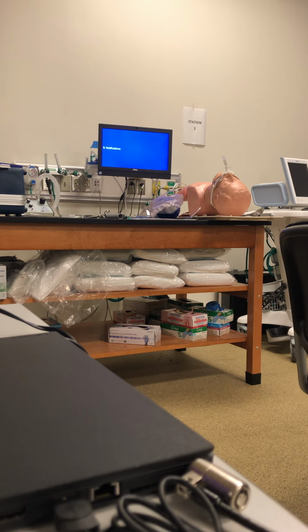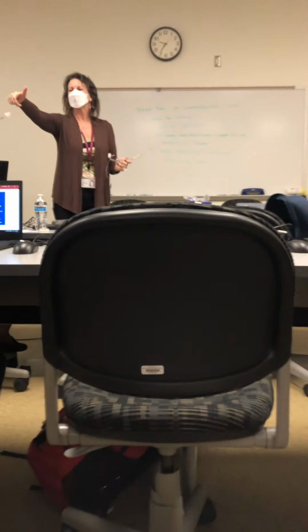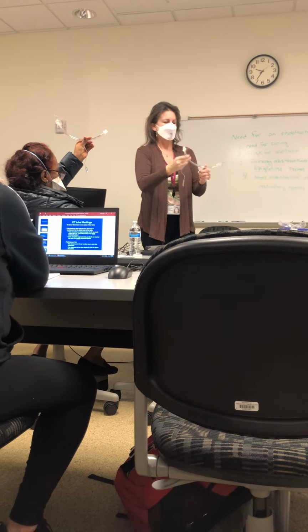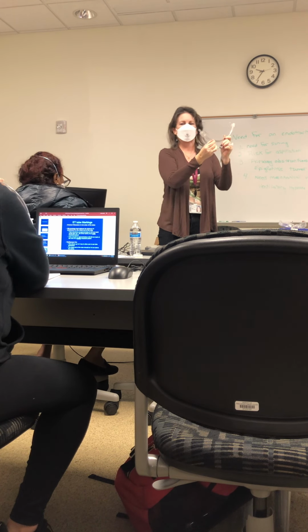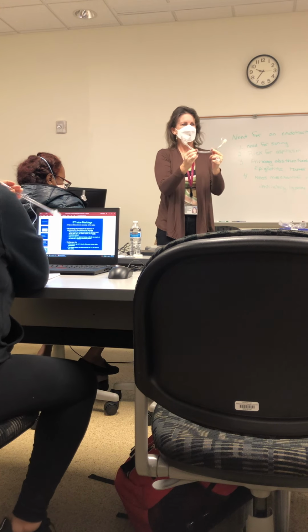7.5. So hers, show them. Hers is at the top. It's up here. Mine is 8.0. Mine is right here. And it's in millimeters. Does everybody see their tube size?